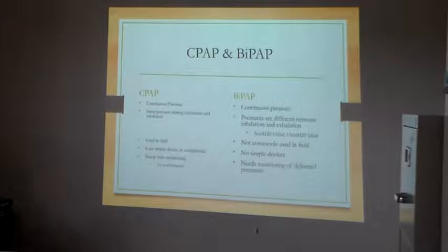You may constantly have to change settings to make sure your patient's getting what they need. And again, at the end of the day, it all boils down to price. CPAP is way cheaper. BiPAP, good luck. Okay? Only time you'll see BiPAP on a truck is in critical care peds transport. Okay? When it comes to peds, they spare no expense. Anybody else, they're like, good luck.